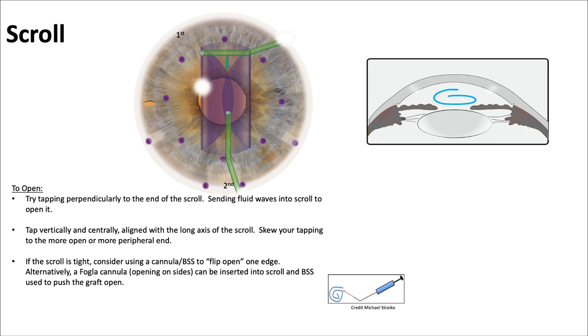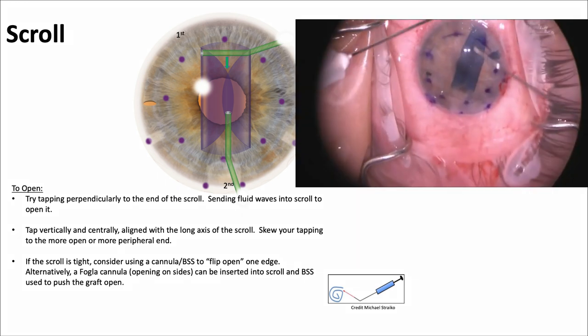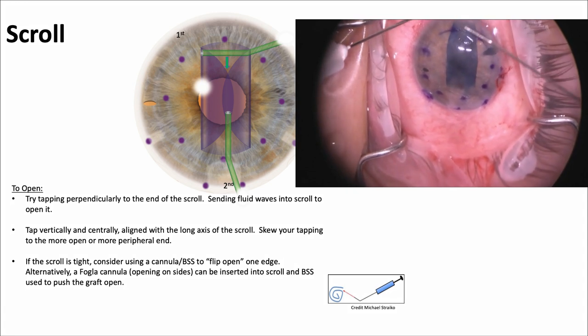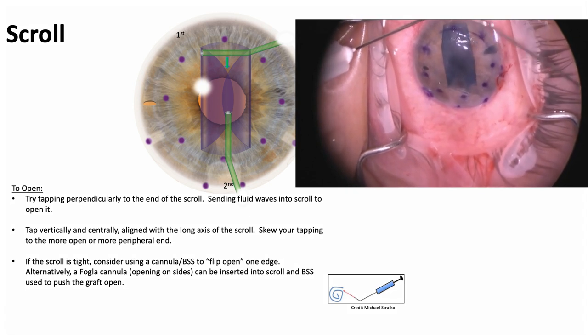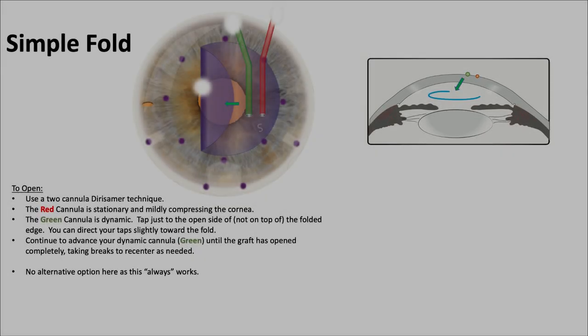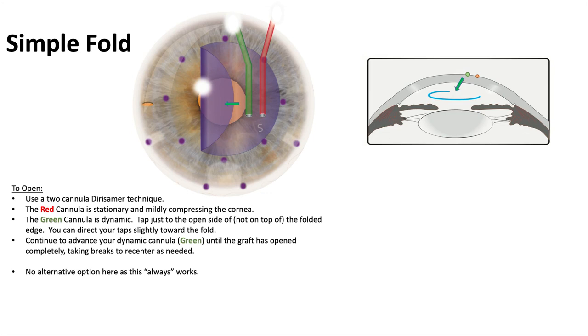Dr. Veldman has a beautiful explanation and video of how to solve each one. Let's start with the scroll. You tap perpendicular to the end of the scroll — that'll send a fluid wave down it to open it. You can tap centrally and vertically aligned with the long axis, skewing the tapping to one end or the other. And if it's tight, you may even use a Fogla cannula to insert and inject some BSS. Light tapping motions send fluid waves right down the middle, and those help to open up the scroll.